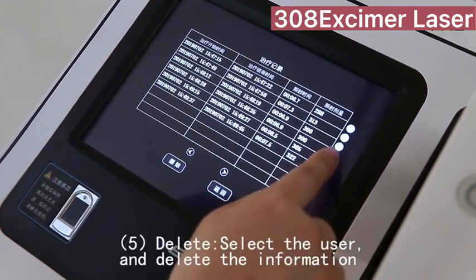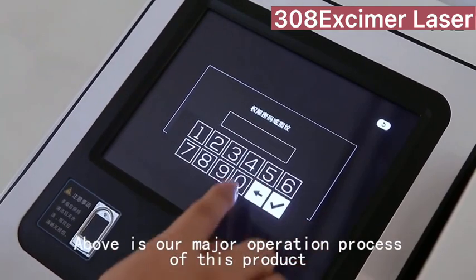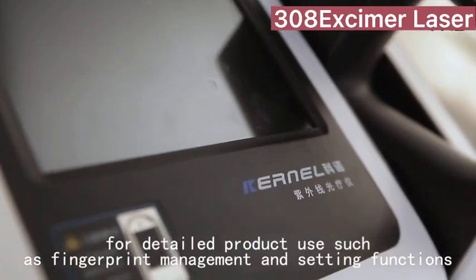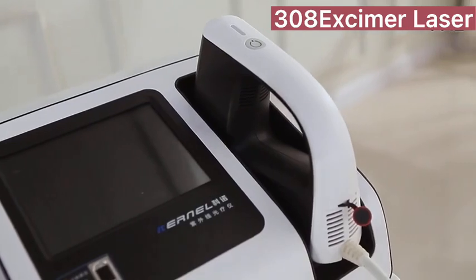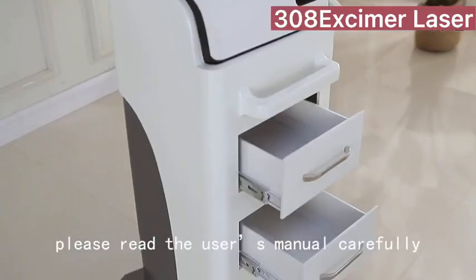To delete, select the user and delete their information. The above covers the major operation process of this product. For detailed product use such as fingerprint management and setting functions, please read the user manual carefully.